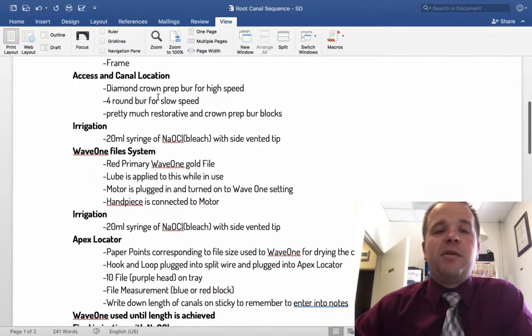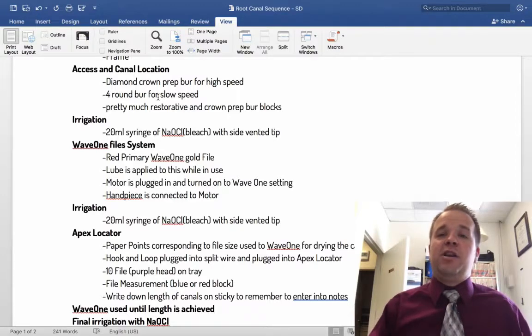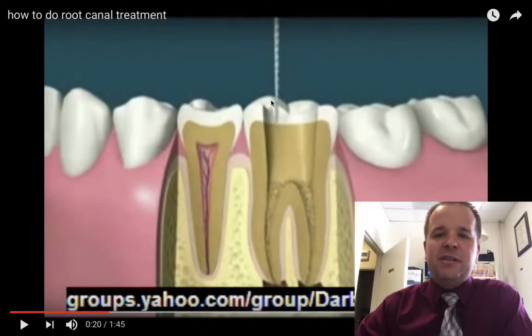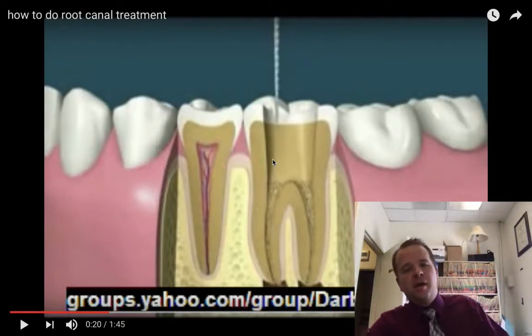The first step that you're going to do is, just like a filling, you're going to use the high-speed drill at first, and to go through the pictures, you'll have this, and you're going to make this hole right here in the top of the tooth. And once that hole is made, just a second here.